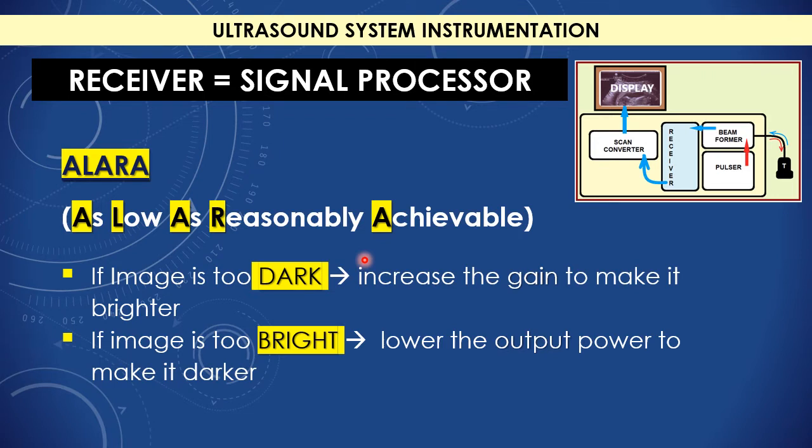So what shall I do? If the image is dark, I want to make it brighter. I don't want to expose the patient to extra output power. So I magnify the gain from this step to the display. I'm not touching the patient, so I'm increasing the overall gain, and I make the image brighter through this step.